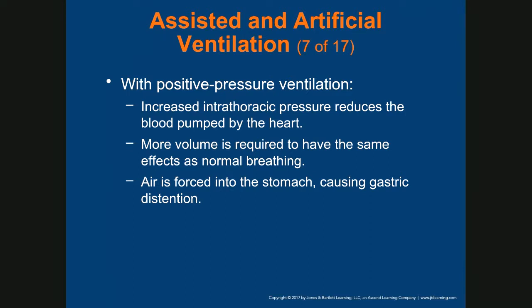Now, the point of the story is if you're in charge of the airway, make sure you're doing it properly, right? Make sure you're using proper technique, proper positioning, your timing is appropriate, right? It is one breath every 5 to 6 seconds for an adult. So it's squeeze, 2, 3, 4, 5. Squeeze, right? Very important.